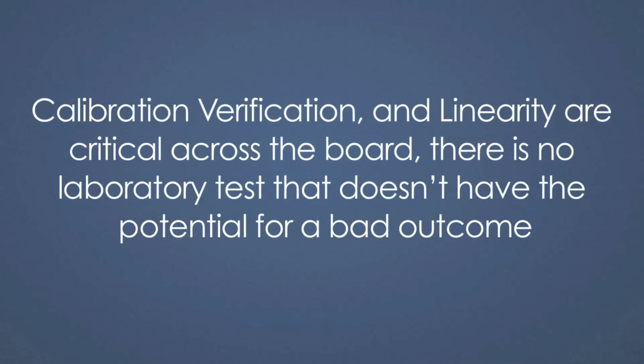Well, it's critical really across the board. There's no laboratory test that we perform which doesn't have the potential for bad outcomes if the results are incorrect. I mean, that's why we're measuring these things, because they are clinically important. To think of a specific example, however, that recently arose, in the case of vitamin D measurements, it turned out that quite a number of manufacturers' vitamin D assays were miscalibrated when we looked at specimens where we knew what the actual concentration of vitamin D was in that system.